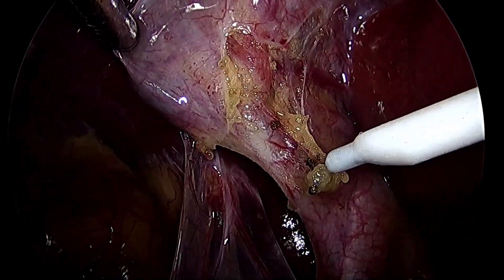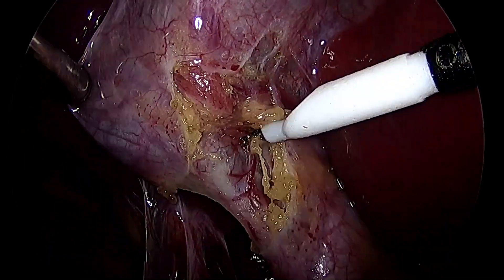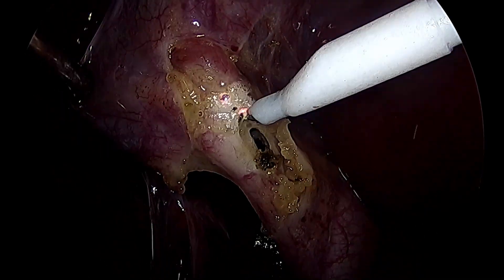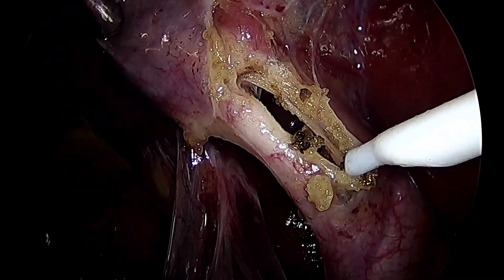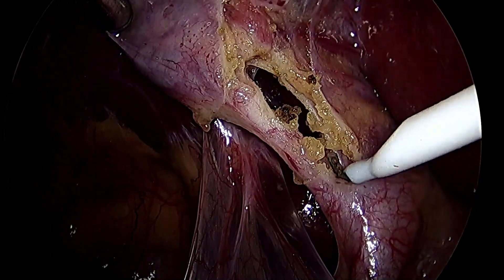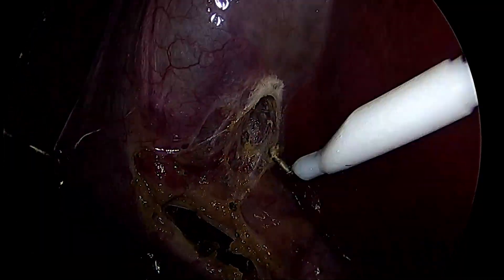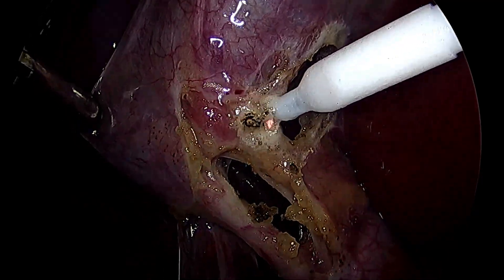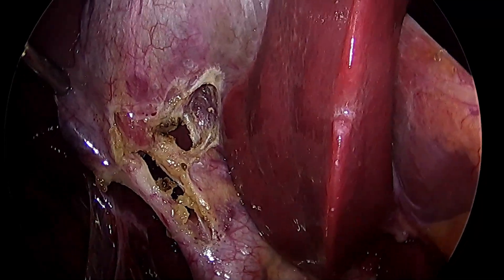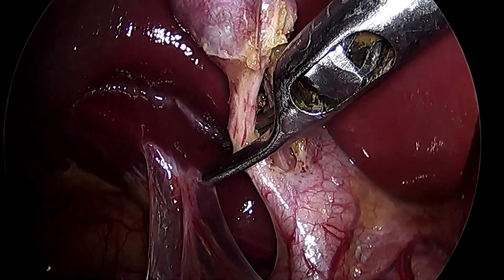Should be careful with the hook in such places — if you don't have control you might injure the CBD, which you can see here. Just creating the anterior window between the artery and the duct. Reaching the junction of the duct to the CBD. Creating the critical view of safety by clearing one third of the cystic plate. As you can see, the critical view of safety is achieved, hence I will be clipping the duct and the artery.